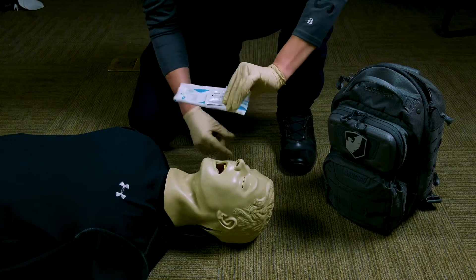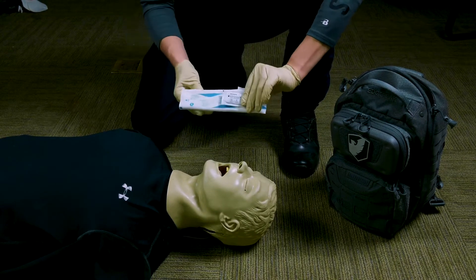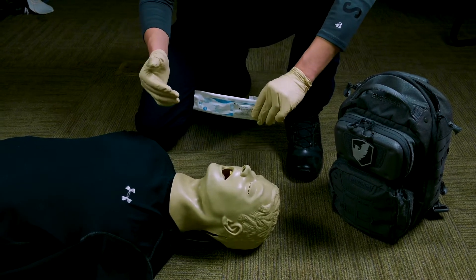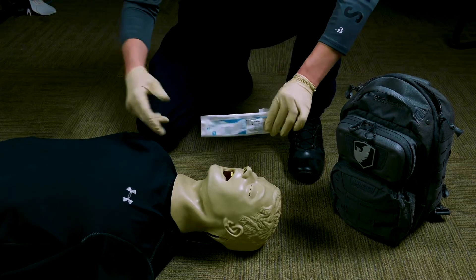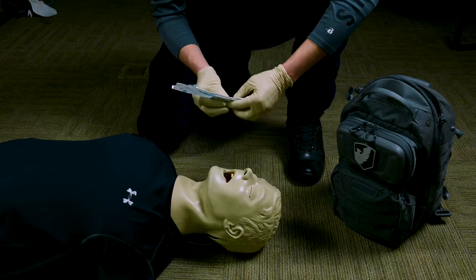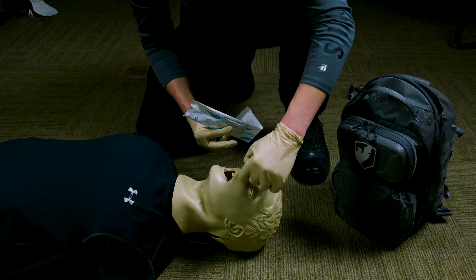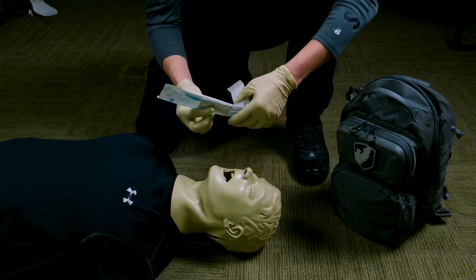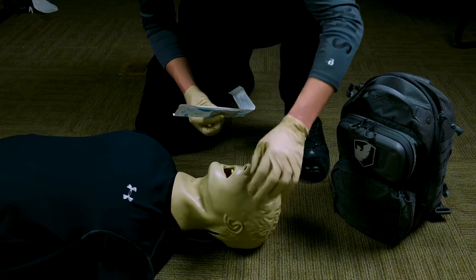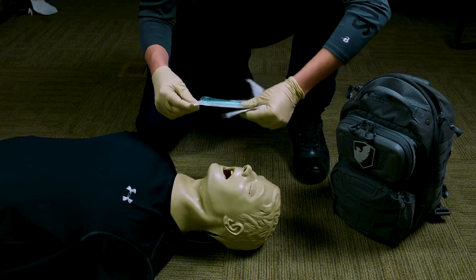We're going to go over how to insert an NPA — a nasopharyngeal airway. I have a size 28 French here, which is a pretty common size — kind of a one-size-fits-most for average adults. The proper way to size the NPA is to measure from the nose to the earlobe, which gives you an estimated size for that patient.